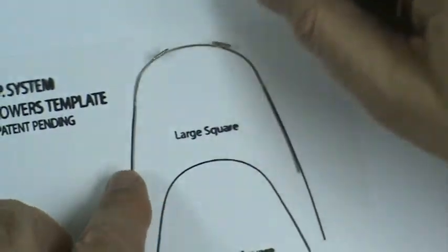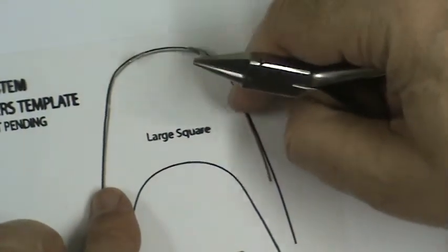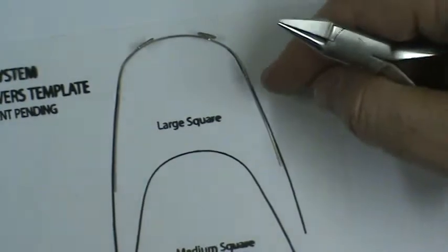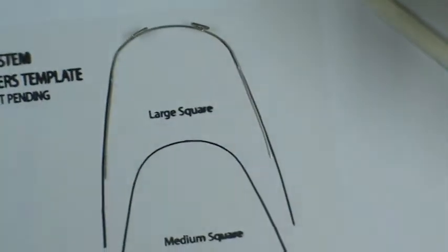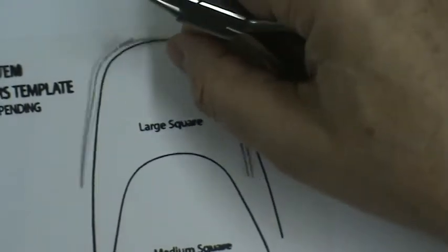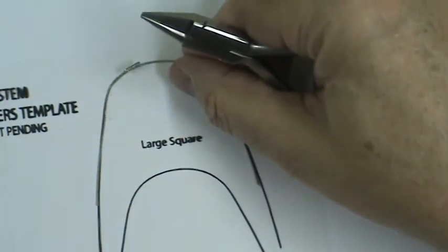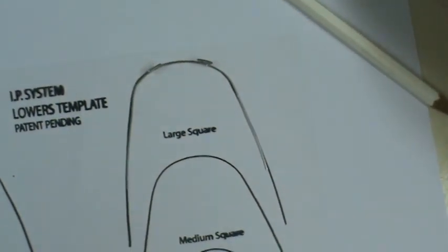The large square is the most difficult to bend. There we go, now we're getting close. So if I can say anything, I would give you encouragement to walk the plier down as you straighten it. I could probably even make it just a little bit wider. Do that with your fingers. There we go. Okay.